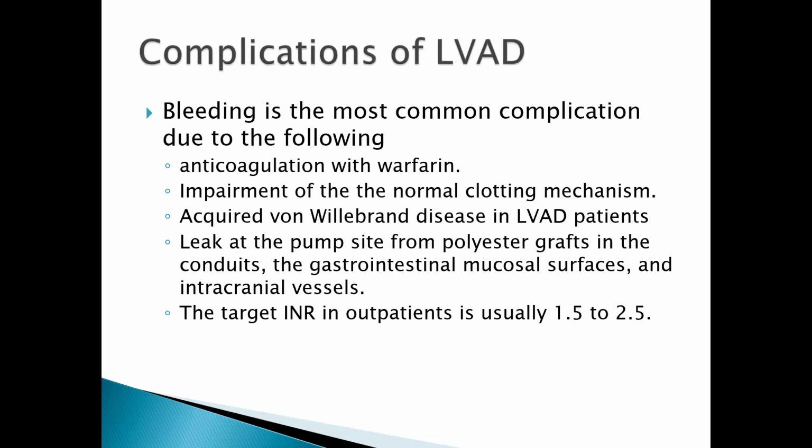So what are the complications of the left ventricular assist device? It's recorded that bleeding is the most common complication, due to the fact that patients who are on anticoagulants may tend to bleed, or there may be impairment of the normal clotting system, or the patient may have had an acquired von Willebrand disease. It can actually cause bleeding in this patient. And also the leak at the pump site has been shown to be one of the reasons why these patients may bleed. And it's said that patients who have been placed on this left ventricular assist device should have a target INR of 1.5 to 2.5, especially for the outpatient basis.